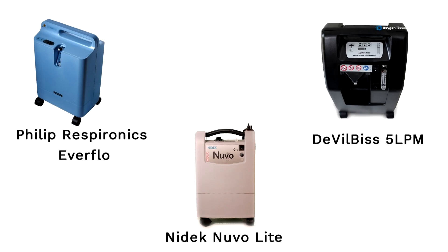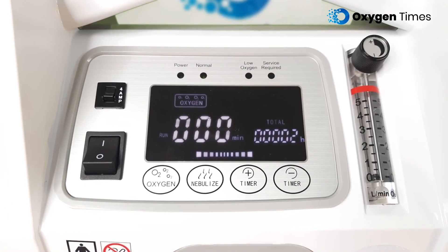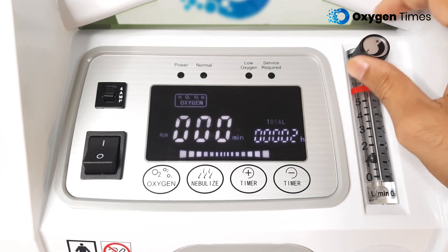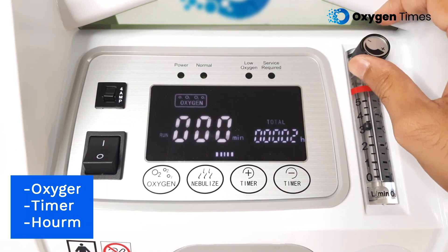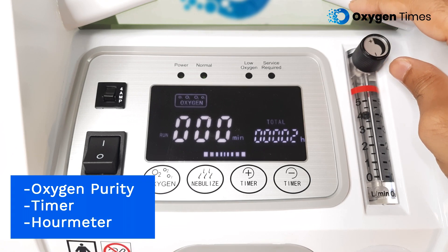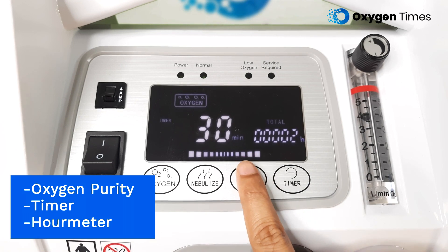Even the most expensive and well-known oxygen concentrators in India, like Philips Respironics Everflow, Nidek Nuvo Lite, and DeVilbiss 5L, do not possess this feature. Moving on, the company has introduced a beautiful LED screen making the overall look of the machine modern and elegant. The LED screen displays Oxygen Purity, Timer, and Run-Meter. Right under the LED screen, the machine has 4 touchpad buttons which allow you to operate the machine.